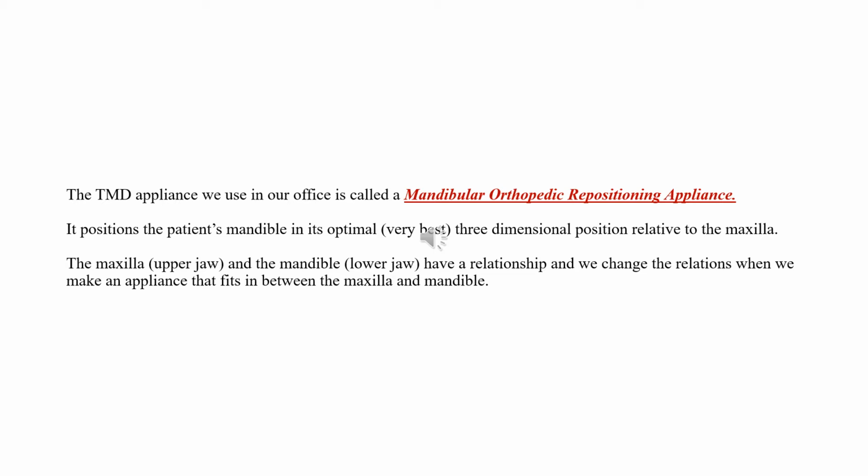It positions the patient's mandible, lower jaw, in its optimum, or very best, three-dimensional position relative to the maxilla.